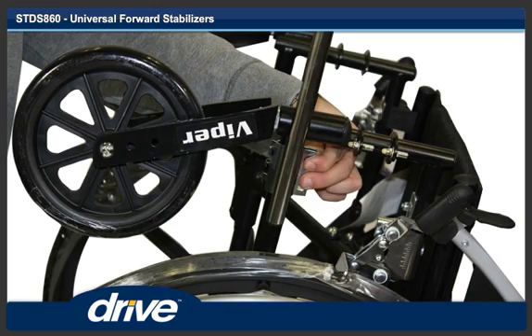Step 4. Install the hinge clamp bracket onto the main body of the front anti-tipper and hold in place.